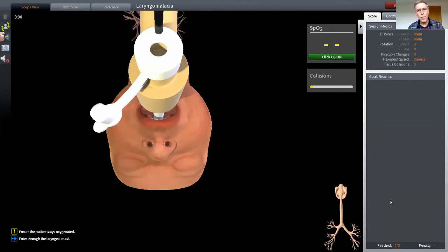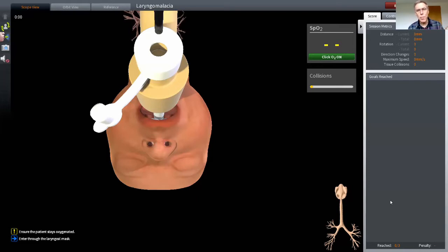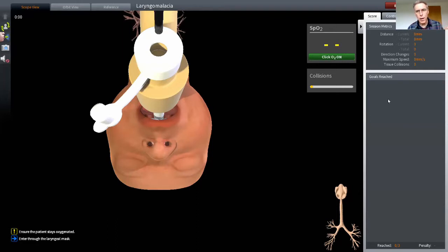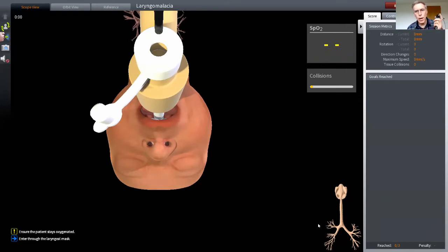Now, one thing I want to mention before we start going through this baby with the bronchoscope, a couple of basic airway points. They are to maintain oxygenation and avoid trauma. So built into the simulator is an oxygen supply, and it's monitored with a pulse oximeter. That can be activated by clicking on the button on the top right corner there, or you can use button three on your handset.